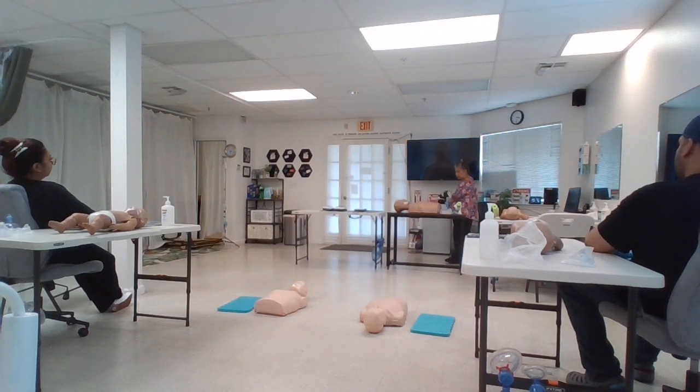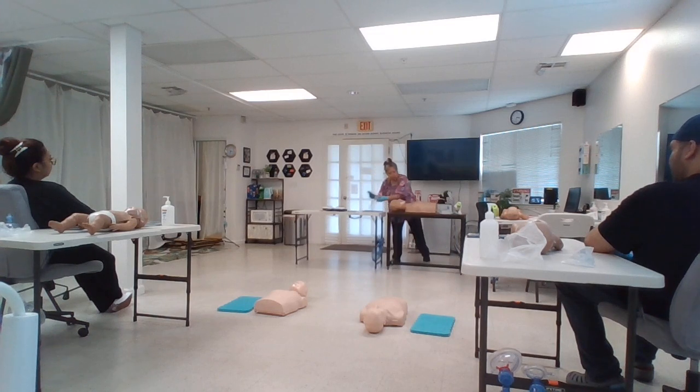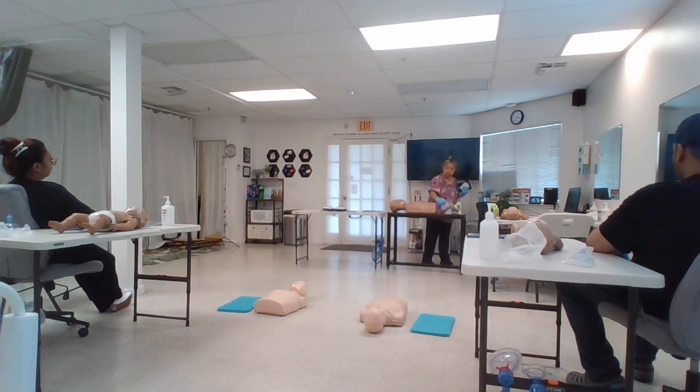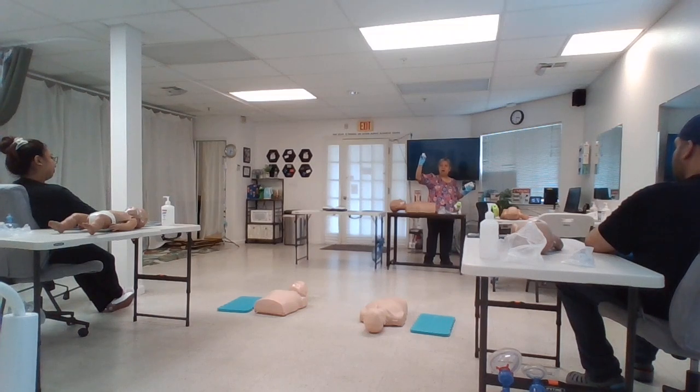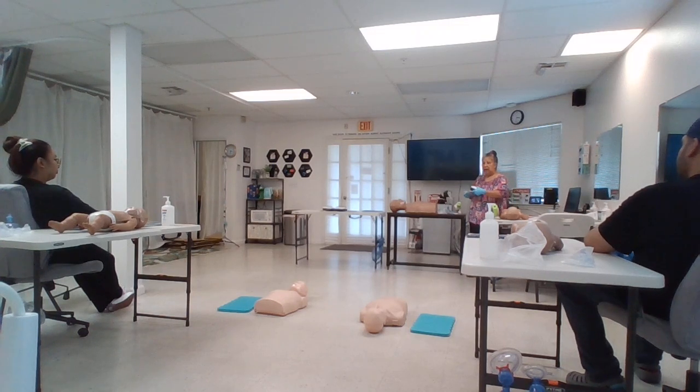Okay, so usually an AED machine will have these pocket masks, scissors, a barrier device, razors. It could be small, big, or medium size. So you have everything you need to use the AED. Now the AED machine that we're going to use right now will be a semi-automated AED machine that we set up.